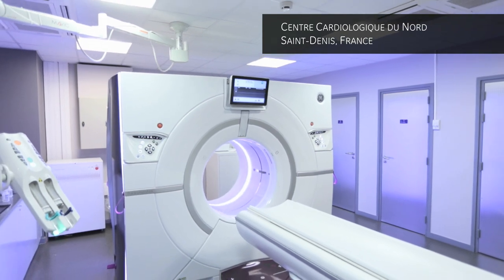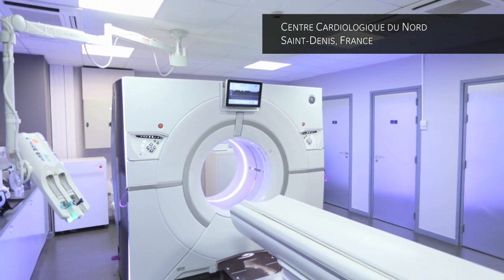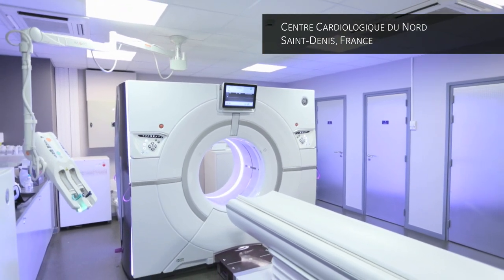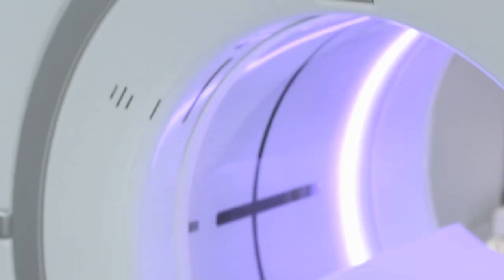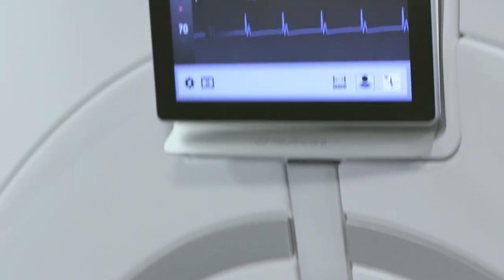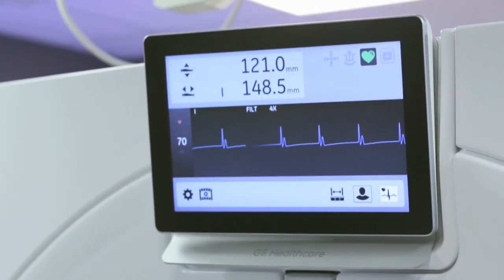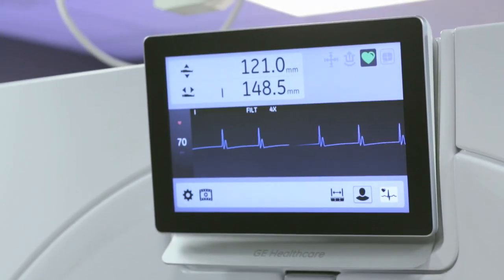In cardiac imaging, you can use Revolution CT to acquire one-beat motion-free coronary images at any heart rate, even for your most challenging patients.